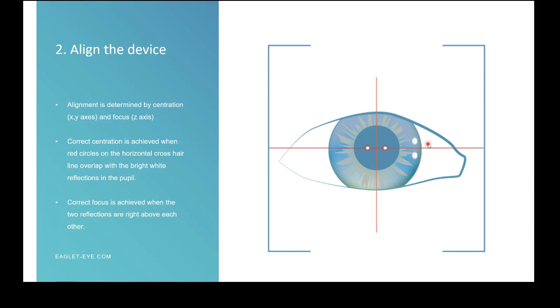Yeah, true. And we will always come and train you for half or a full day. So we spend a lot of time making sure that you understand the whole process. In the beginning, it takes you time, especially because you have to instill the fluorescein and check all the quadrants of the eye. But taking the measurement itself, it's really easy.